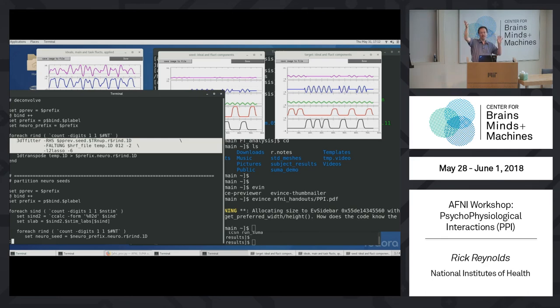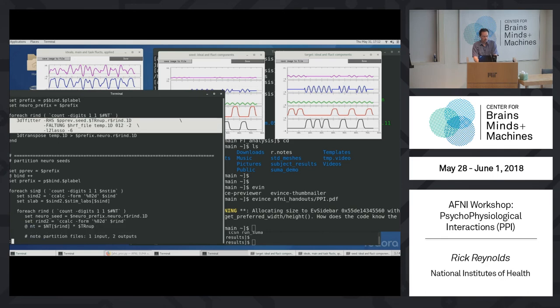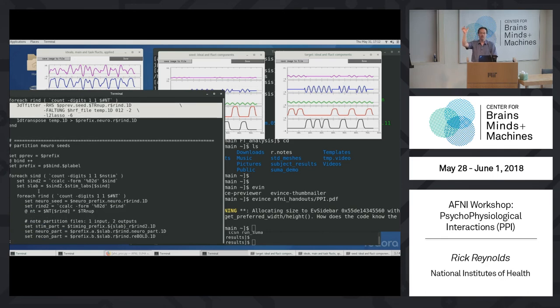So these big BOLD responses, not that we'll see any, should become little neuronal responses in our 2 second box rather than in the 14 second time window. And now we can just multiply the spider time by this deconvolved seed and get a spider seed. Multiply the 0-1 puppy time by our deconvolved seed, and we get a puppy response seed time series.